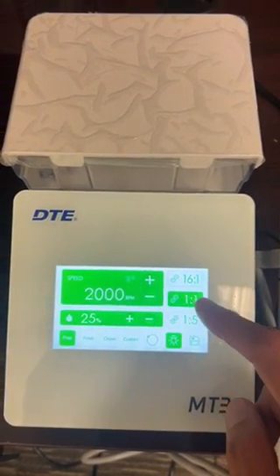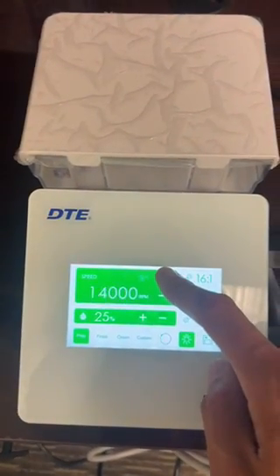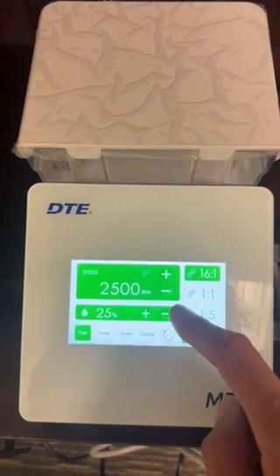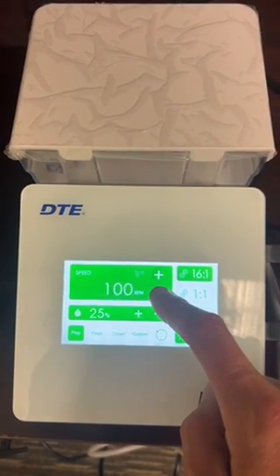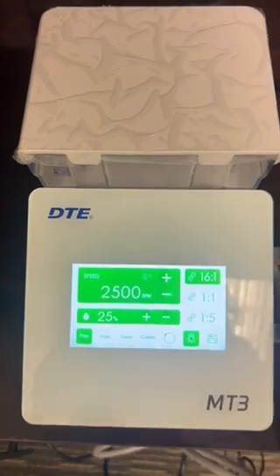If you wanted to check out the 1-1, it goes all the way down to 2,000 and all the way up to 40,000. And then the 16-1 goes as low as 100 and all the way up to 2,500.